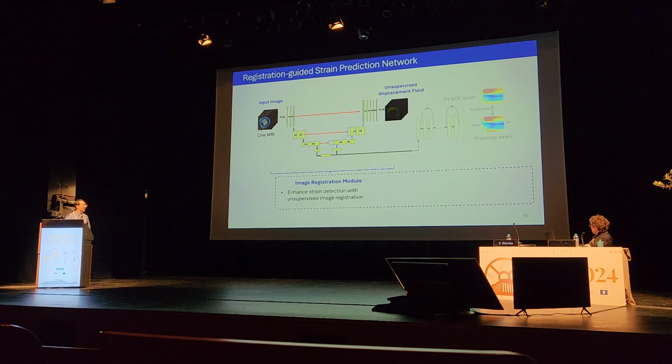So we can make an easy motion-to-motion transfer rather than the harder transform from image to motion, and this enhances the robustness and accuracy of the whole network. Particularly, we use unsupervised latent features because they have lower dimensionality and can improve efficiency. They also have richer information for the final LMA detection. And here's the loss function, which is weighted on registration similarity, smoothness penalty, and model weight decay.